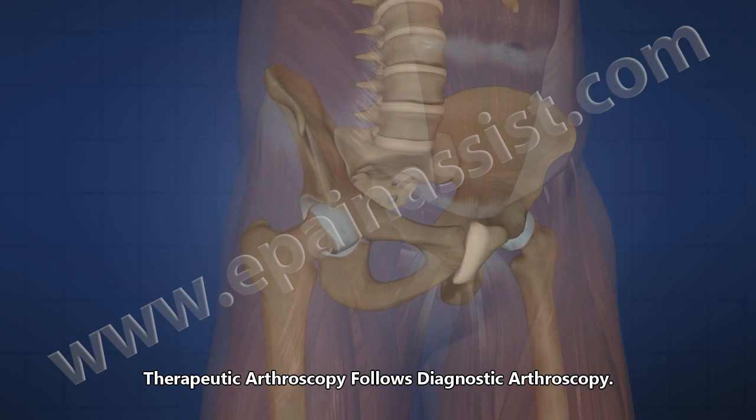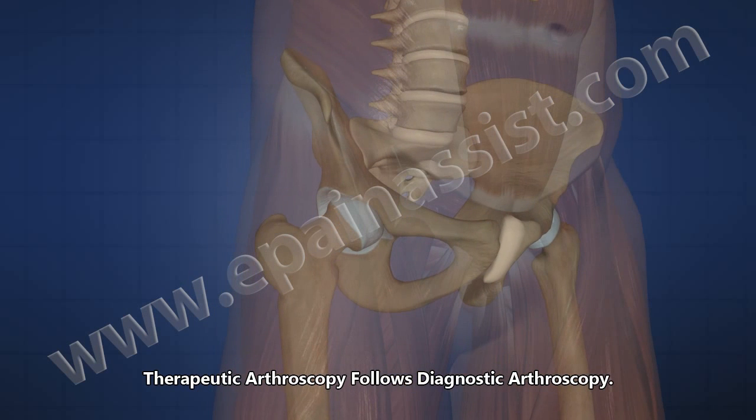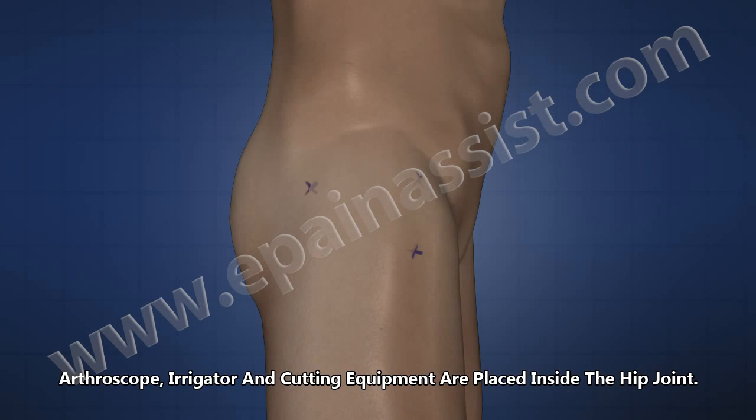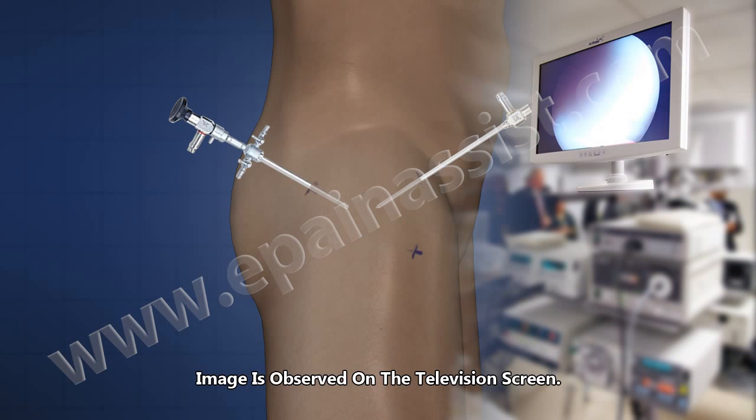Therapeutic arthroscopy follows diagnostic arthroscopy. Arthroscope, irrigator and cutting equipment are placed inside the hip joint. The image is observed on the television screen.